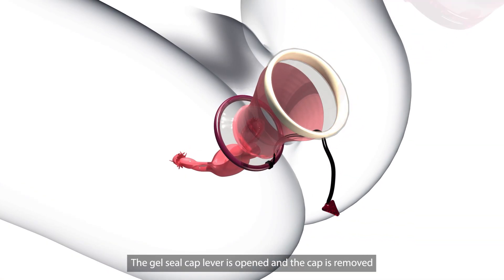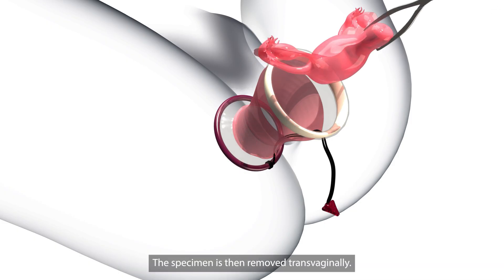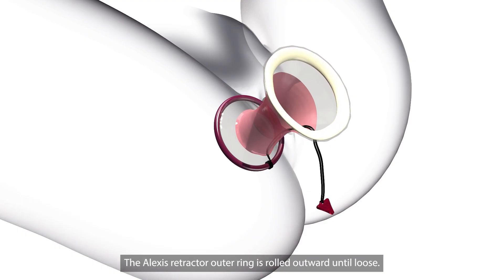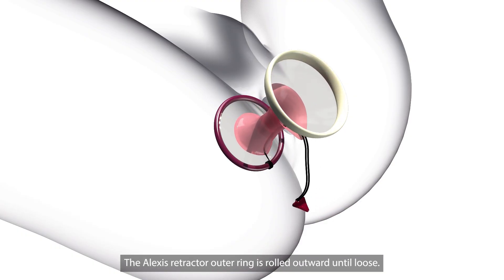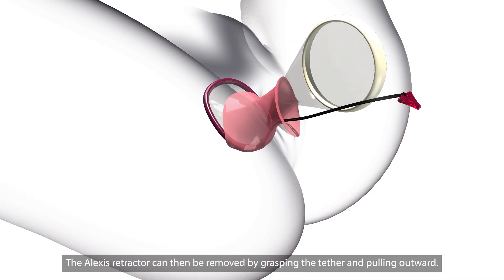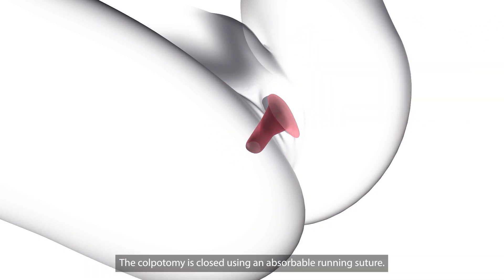The gel seal cap lever is opened and the cap is removed from the Alexis retractor. The specimen is then removed transvaginally. The Alexis retractor outer ring is rolled outward until loose, and the retractor is then removed by grasping the tether and pulling outward.